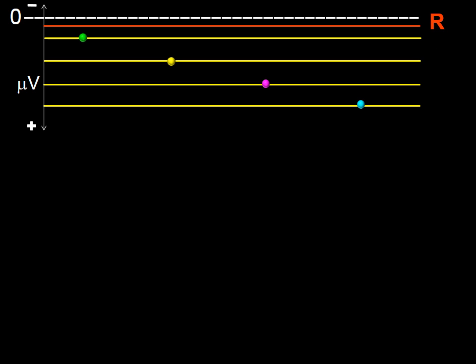In this new frame, I have represented 4 electrodes by adding 4 dots of different colors at different voltage lines. The green dot represents the most anterior position by virtue of its proximity to the vertical double-headed arrow line, and it is also the minimal positivity since it is the electrode that is closest to the neutral line or the 0 line.